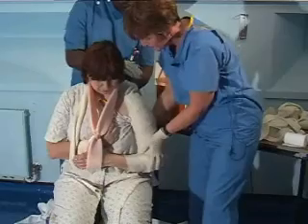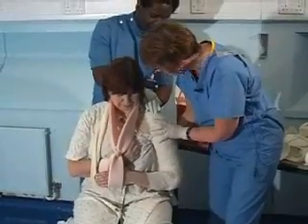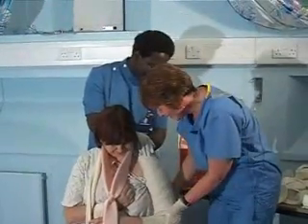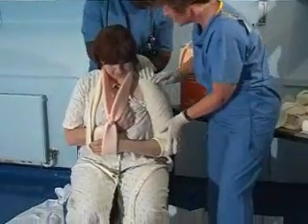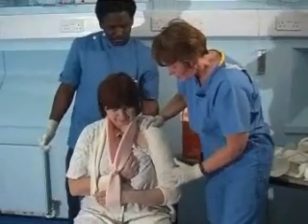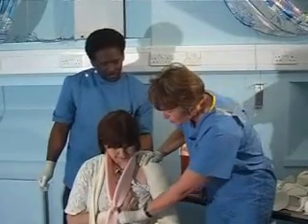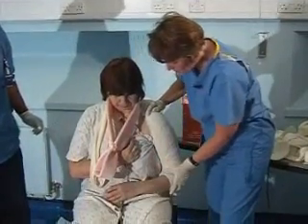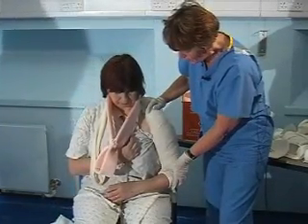The plaster will get warm because of the chemicals in the plaster. The idea is to have the water lukewarm but not hot. I can fold this part up and let it sit there. If this is a little bit too flexed, I could adjust the sling and take it down a little bit if the patient feels too uncomfortable. If she feels more comfortable with her elbow at less than 90 degrees then we can take it down a little bit, but ideally we should put it in a good functional position if the fracture allows that.